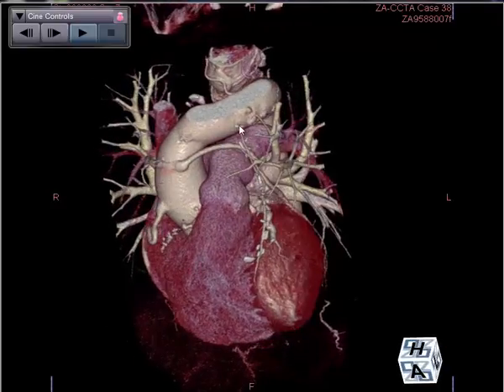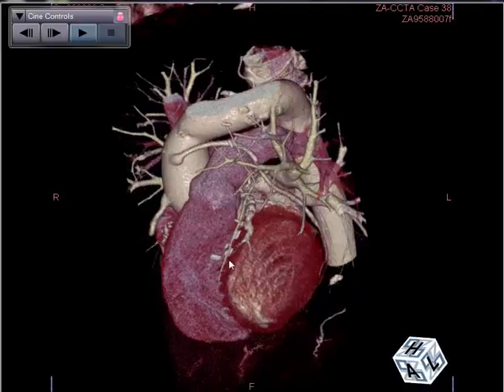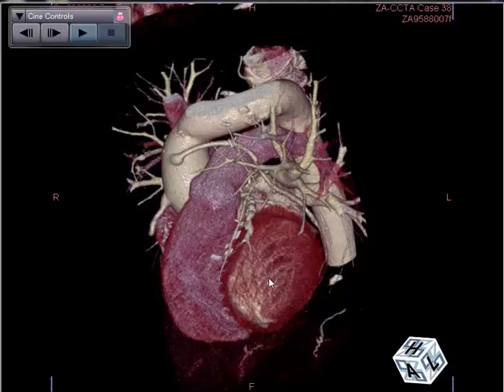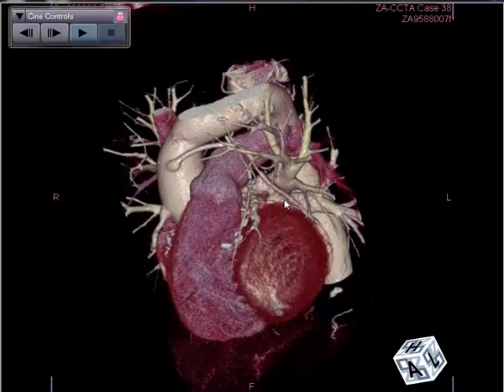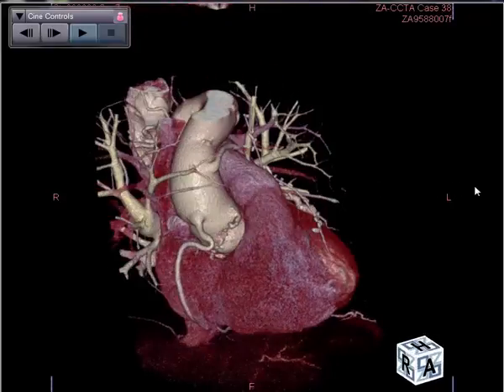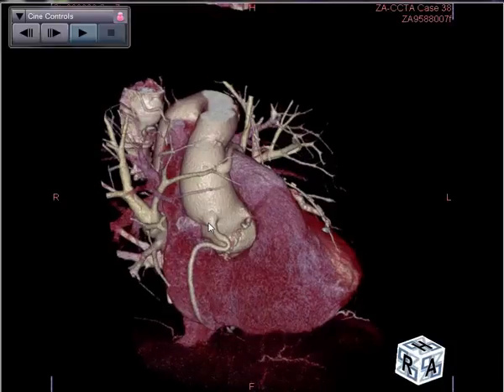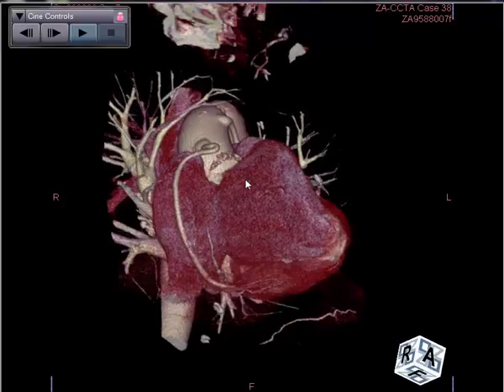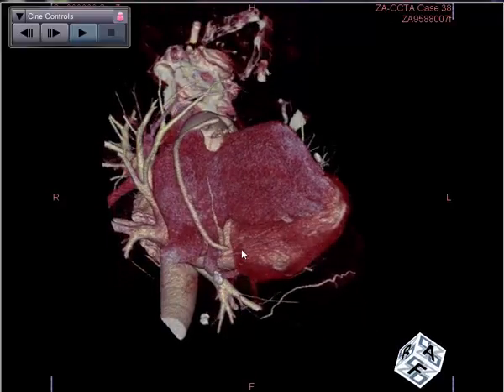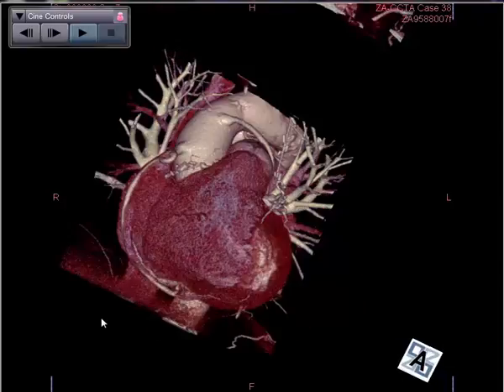There is an internal mammary artery bypass graft coming to the region of the left anterior descending. There is a saphenous vein bypass graft that appears to be going to the region of the obtuse marginal. And there is another bypass graft going to the right, passing down into the distal right coronary, feeding portions of the posterior descending coronary artery.